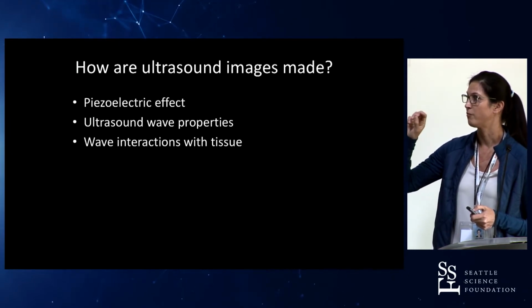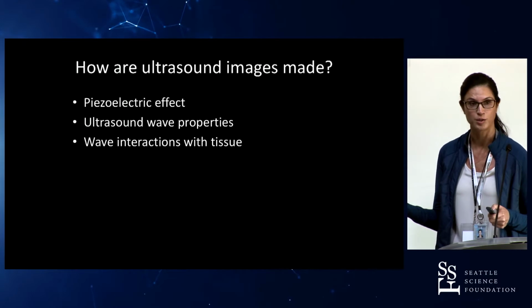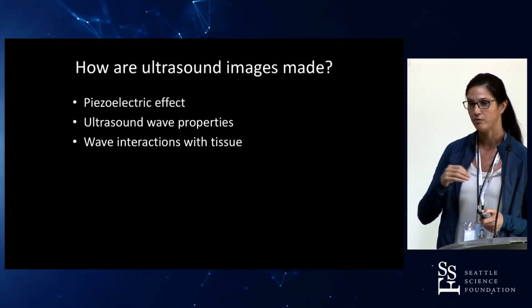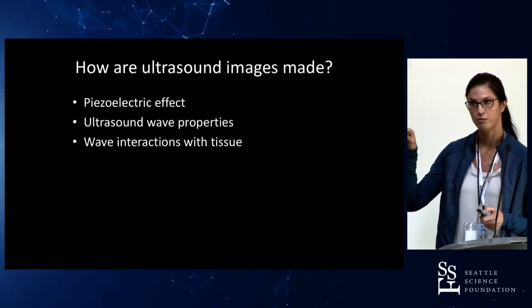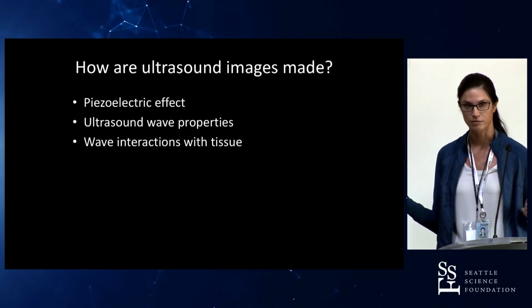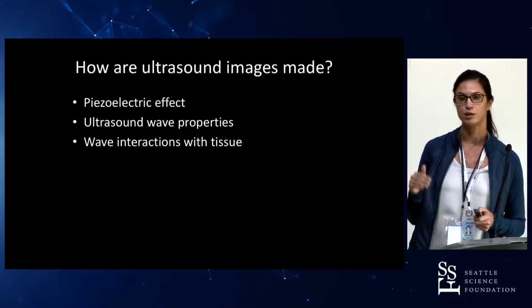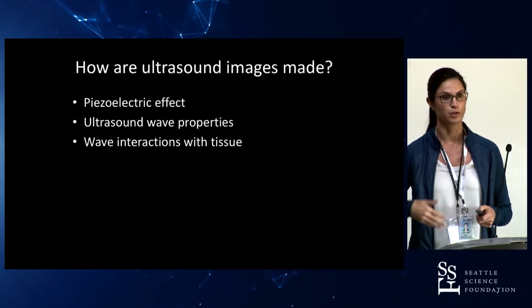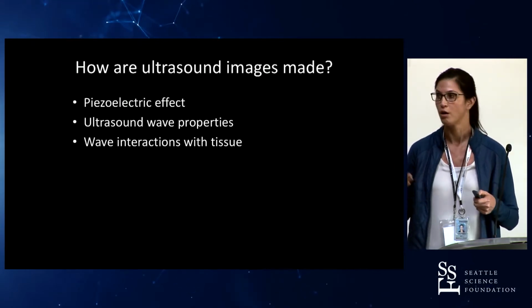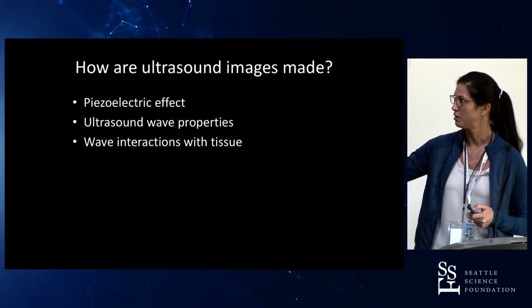Velocity mapping is one of the core principles with ultrasound. It's an assumption that the ultrasound sound wave will propagate at a constant velocity within tissues. So the waves that are reflected earlier are mapped to closer structures. The waves that come back to the transducer later are mapped to deeper structures.